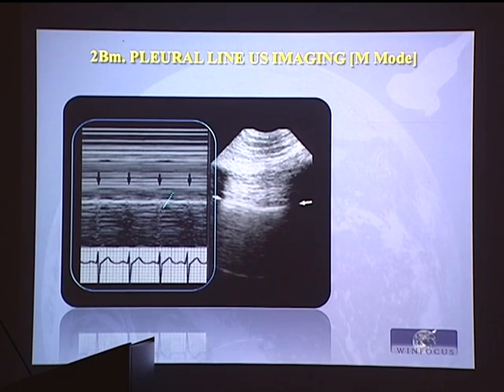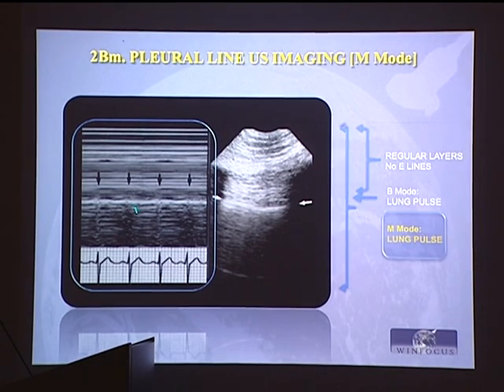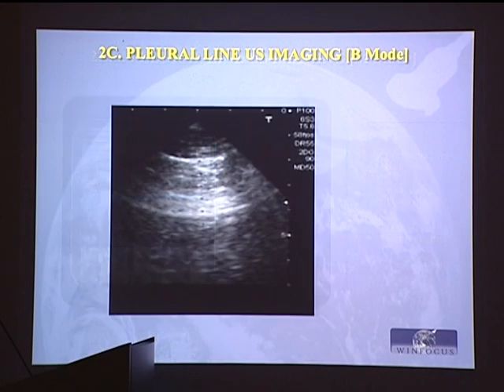This is how it appears in the M mode of the lung pulse, with these pulsatile artifacts on the straight background. So it's not anymore a sandy pattern that we call seashore, but it will be a lung pulse pattern.